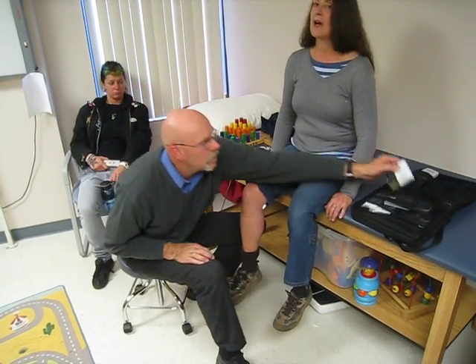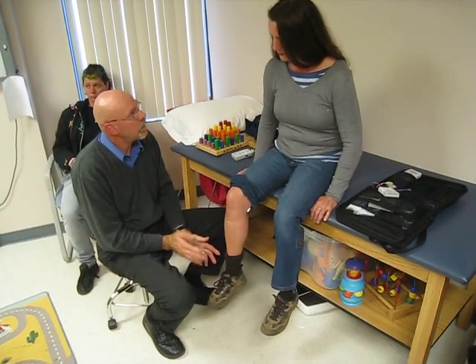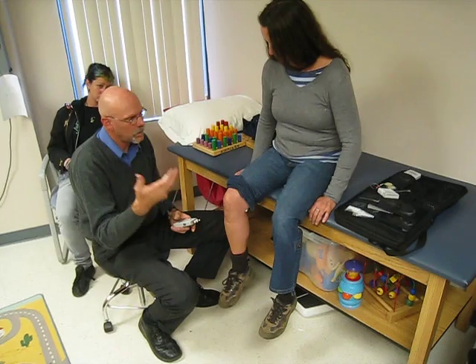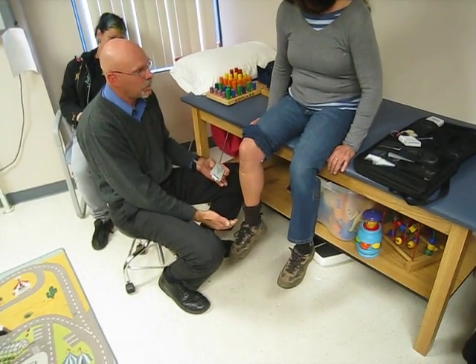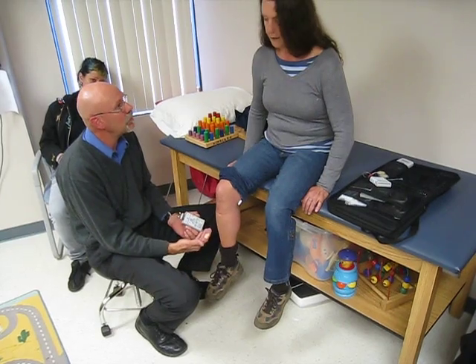So now if you walk fast, slow, uphill, or downhill, it will react as you normally would. Whereas with the brace, it doesn't require batteries, but you have to wear larger shoes and you can't go barefoot — with this, you can go barefoot.